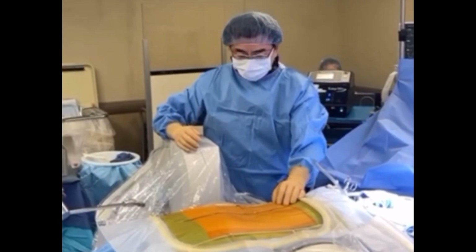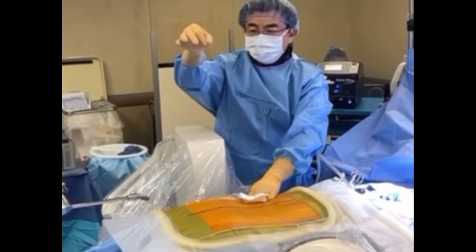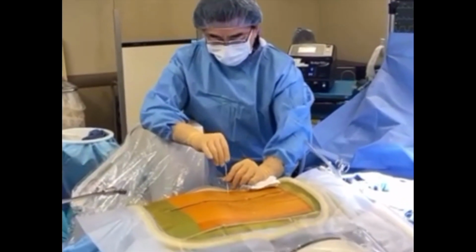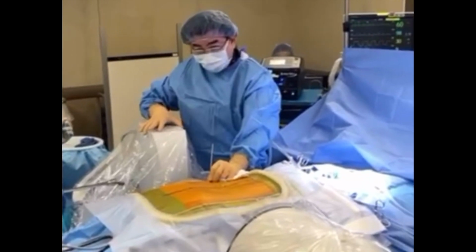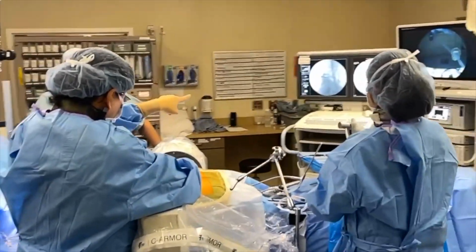Okay, we're getting started. I made the perfect poke hole using intraoperative imaging. And I'm going to use the spaghetti noodle dilator. Look how thin and delicate this is. I'm going to stick my little pinky out, and I'm going to be like Helen Keller right now. But we will get this right to the perfect surgical target site. So I've got the spaghetti noodle dilator exactly where I want it.